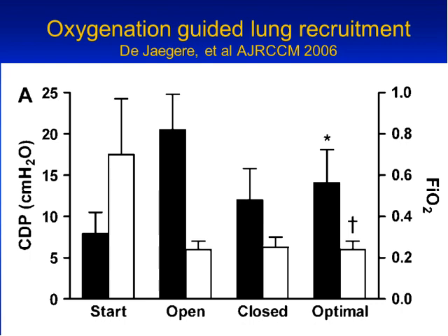They stepwise increase the pressure until saturations improve and they're able to wean FiO2 down to less than 30%. So the second column labeled open, the FiO2 is low, the distending pressure is fairly high, about 20 centimeters. And then they will stepwise reduce the pressure to try to find that sweet spot. So it's important to not leave the distending pressure at the maximum that was needed to open the atelectatic lung. Remember that once you open the lungs, they become more compliant. And so once they're more compliant, they need less pressure to keep open.